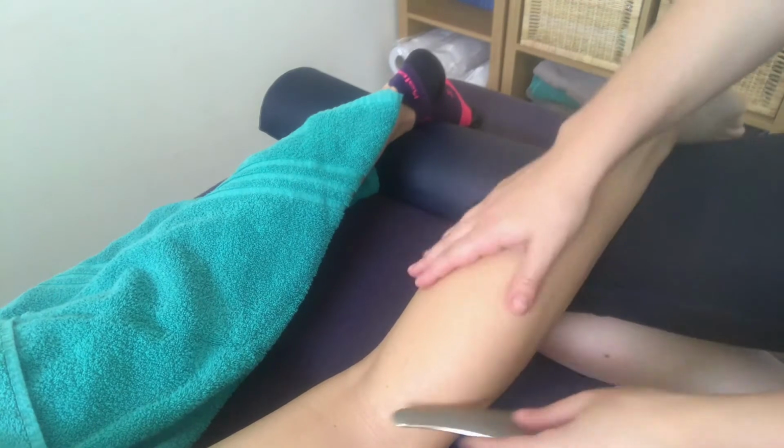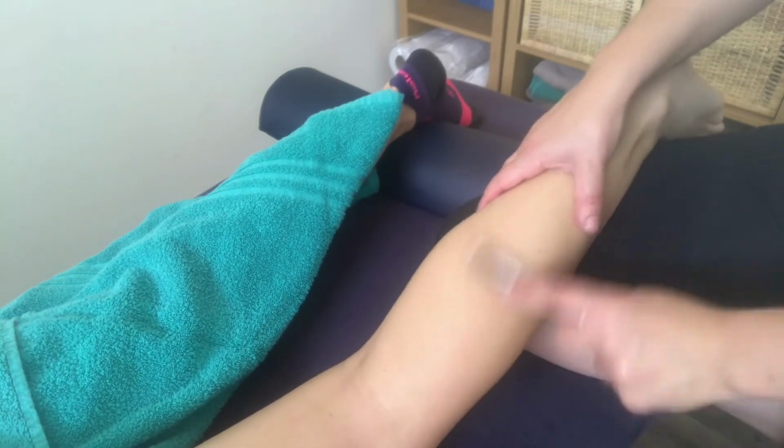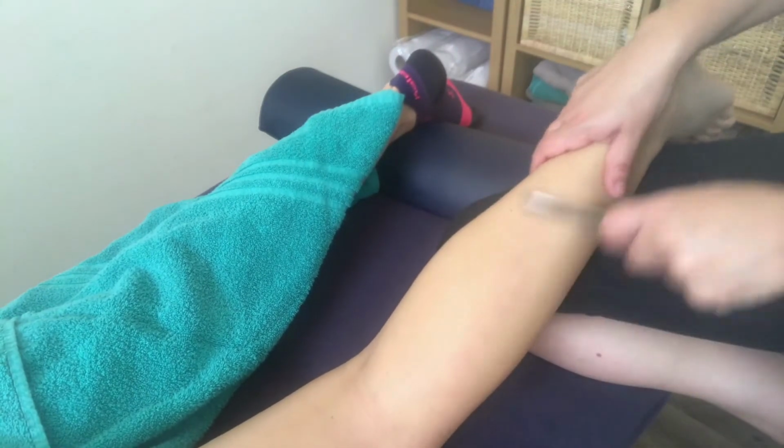So we start with some passive work for gastroc and soleus, so taking a stretch on the skin with the hand and then using the tool above their supporting hand.